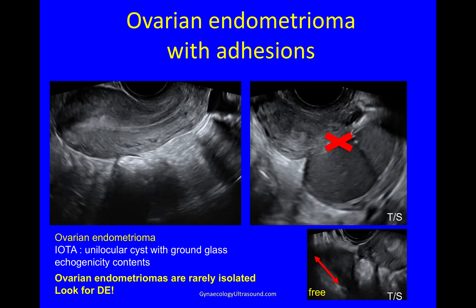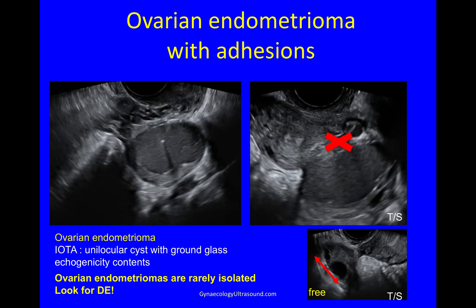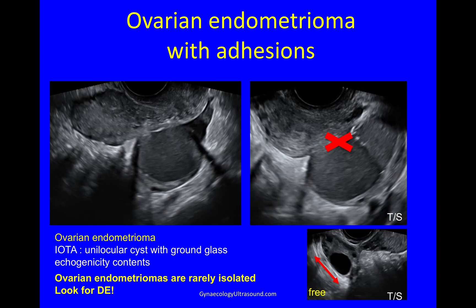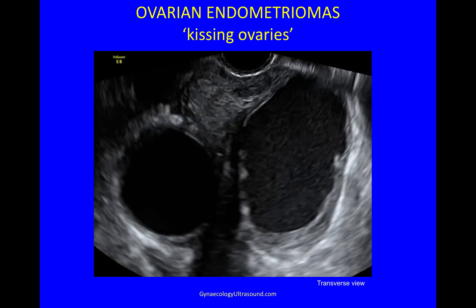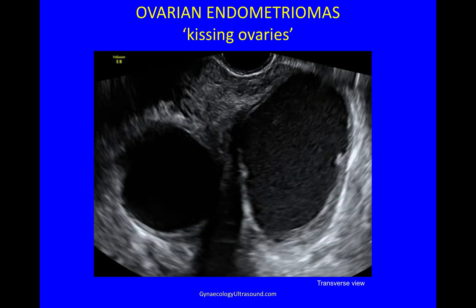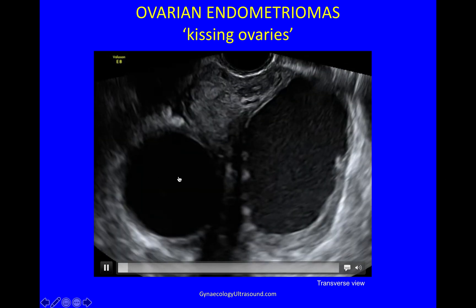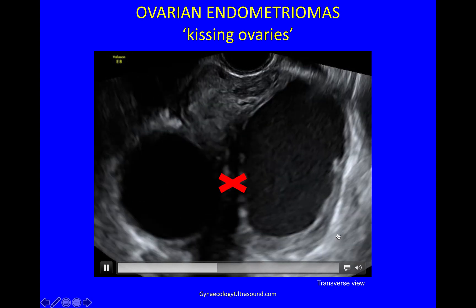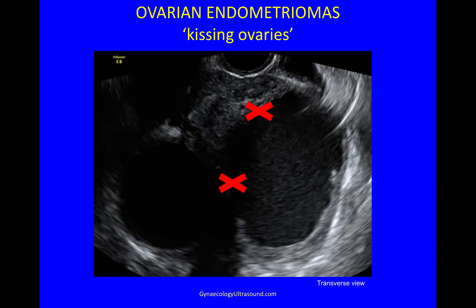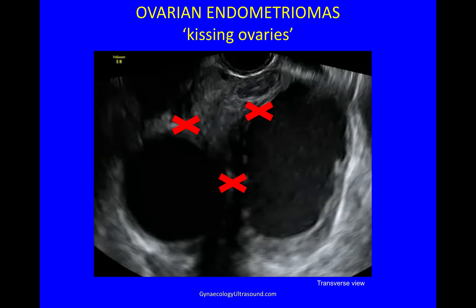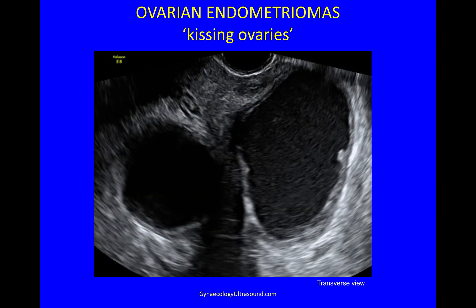Ovarian endometriomas are rarely isolated, so you also need to look for deep endometriosis. But when you're in the transverse plane, you can even here just see that these ovaries are adherent to each other. These are kissing ovaries with bilateral endometriomas, and they're adherent to the back of the cervix as well.